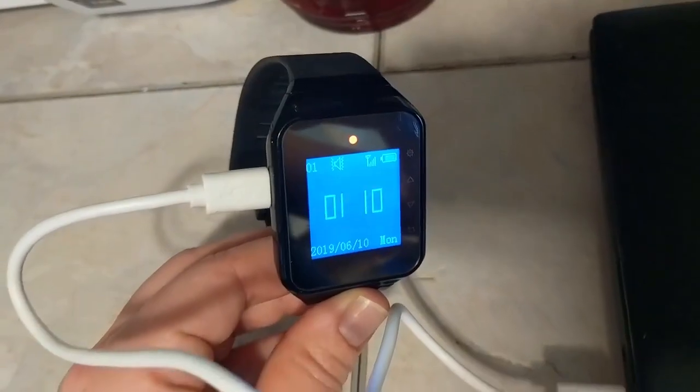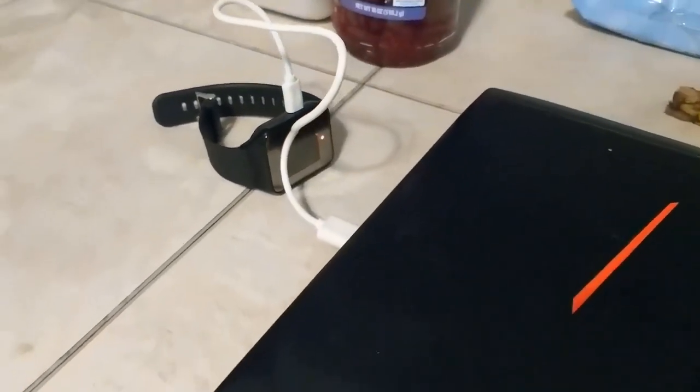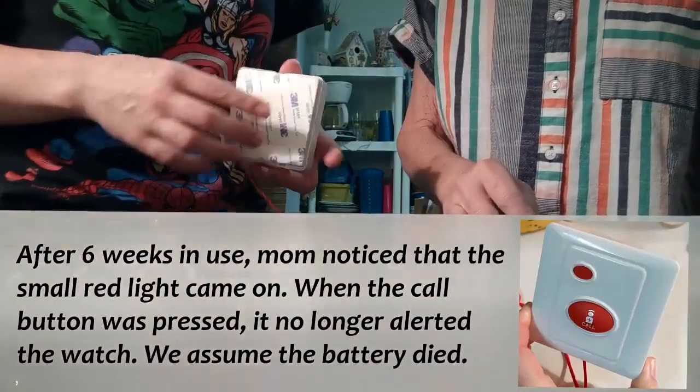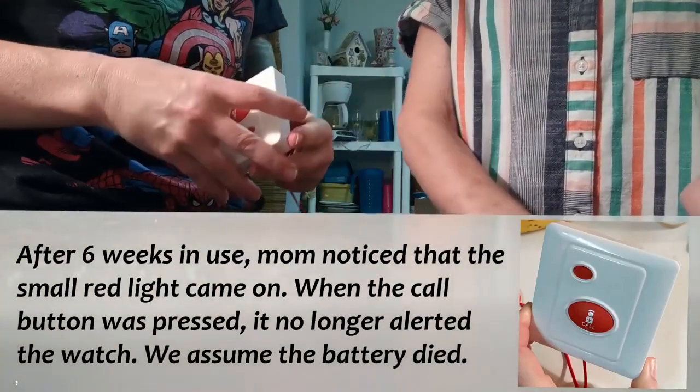Whenever mom is away from the house I take the opportunity to charge my watch. I use the cord that came with the watch and plug it into my laptop, so this kind of becomes my charging station. You don't want to pull that cord.